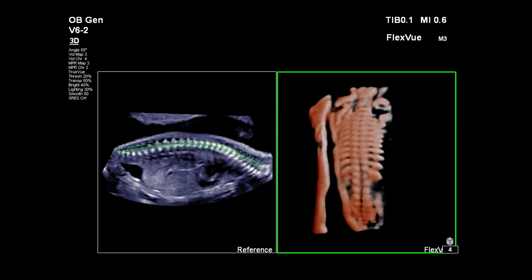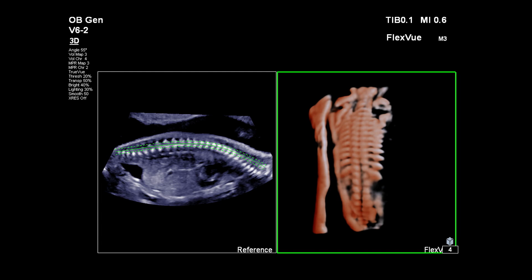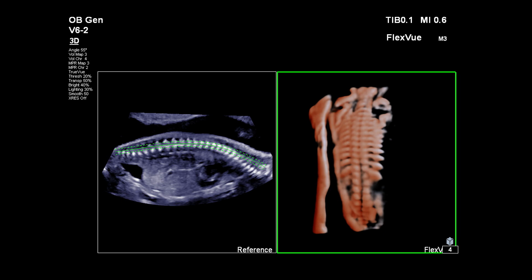This provides the user yet another way to image the ribs and the fetal spine from the cervical down to the sacral regions of the spine, giving us diagnostic confidence that the fetal spine is within normal limits.